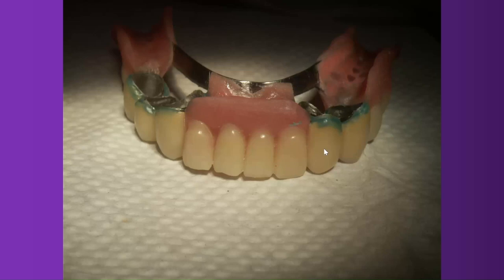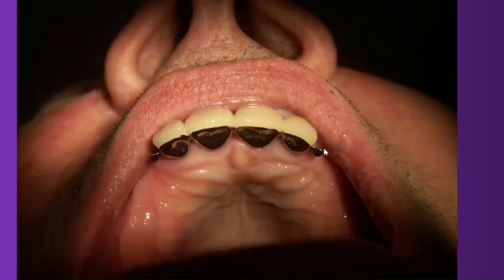Now this is the upper denture. Here you see a much simpler solution, four elements and two distal vertical solutions. We did this like 8 years after the patient had such a denture with spheres, with ball attachments.